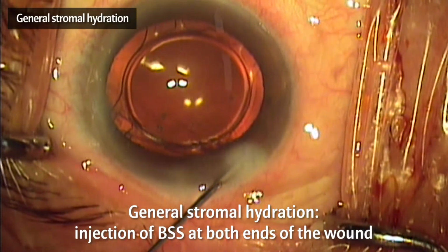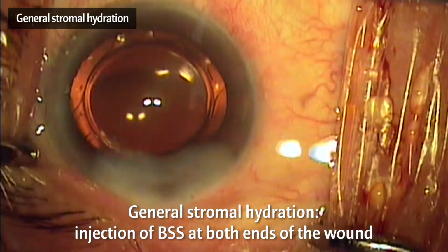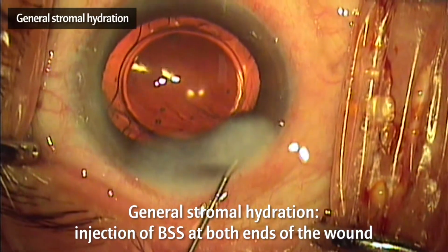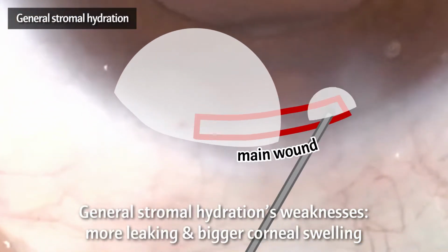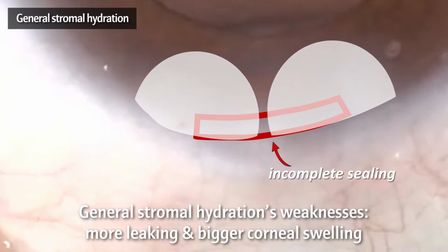Here, general stromal hydration is performed to seal the incision. The cornea is inflated by injecting BSS at both ends of the wound to seal the main wound. As shown in this, when more BSS is injected from both sides to block the center of the main wound, there may be more corneal swelling. Also, there may be leaking when the center of the main wound is not blocked well.